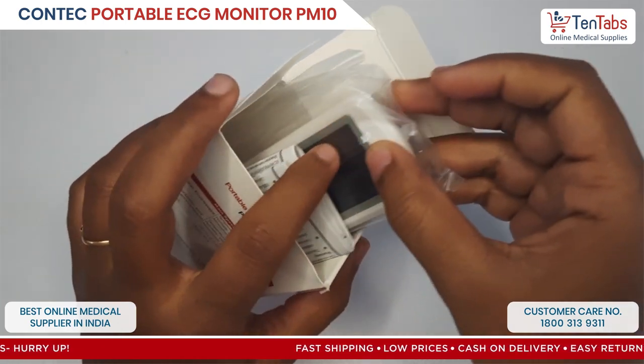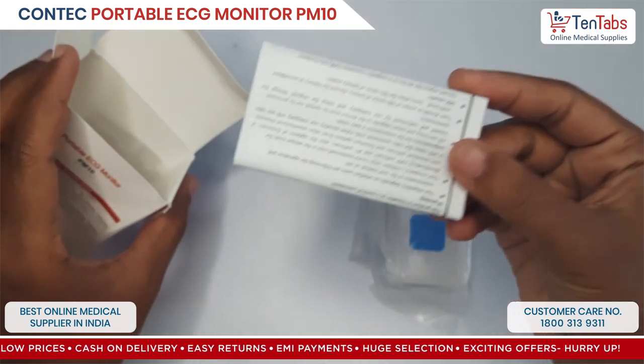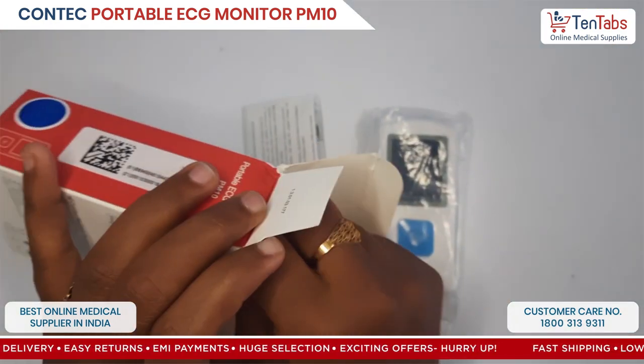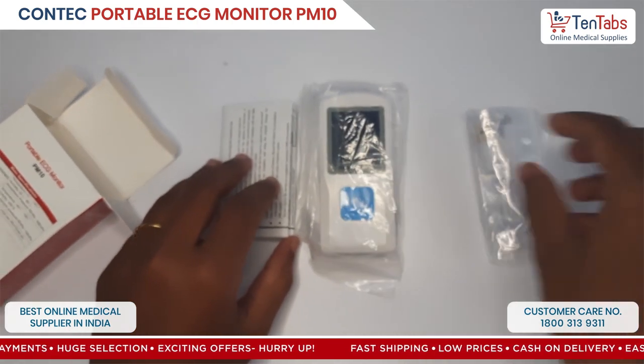The box contains the device, user manual, and a micro USB cable. So this is all in the unboxing.